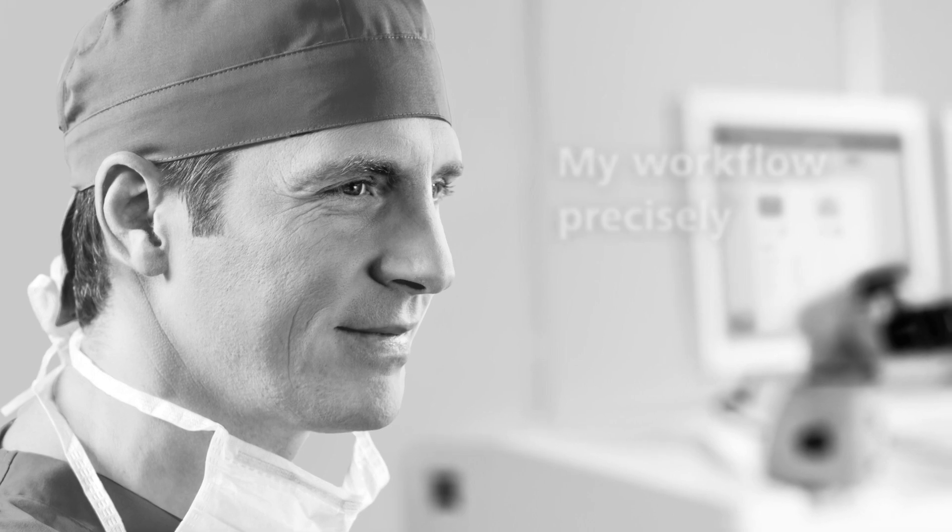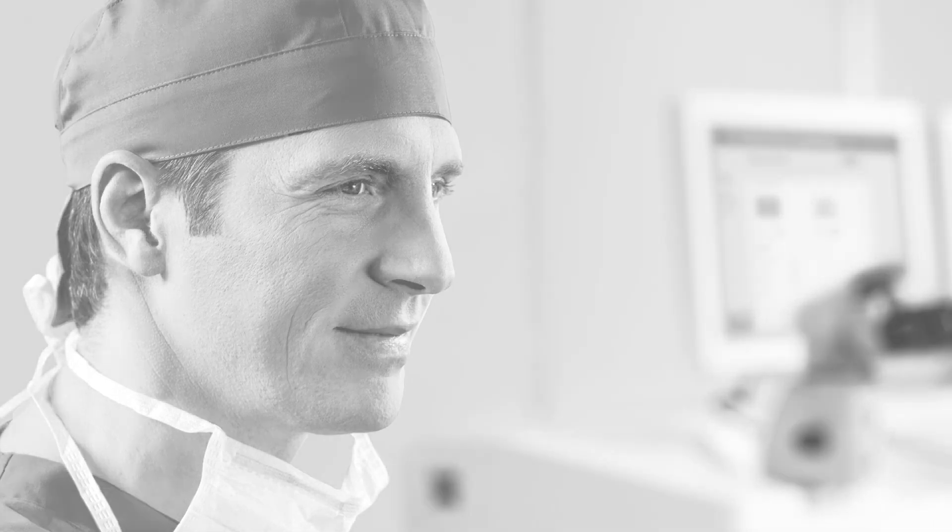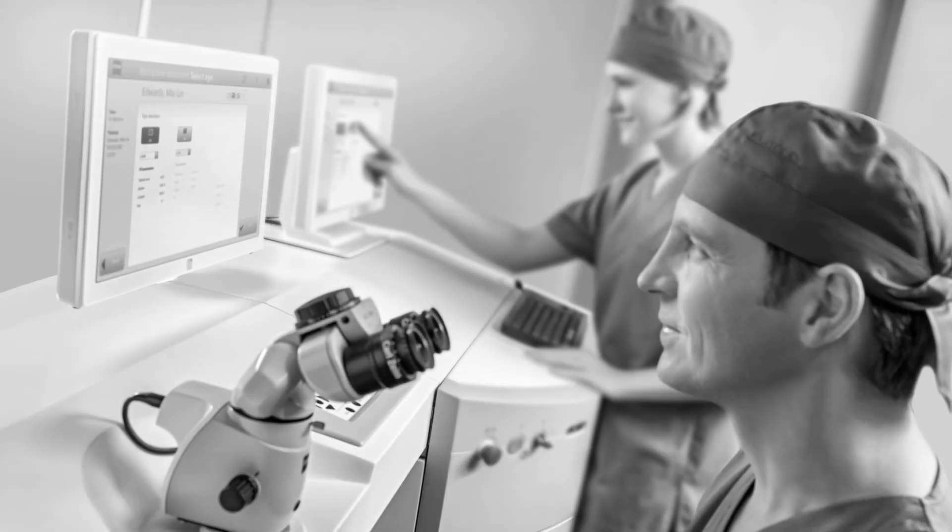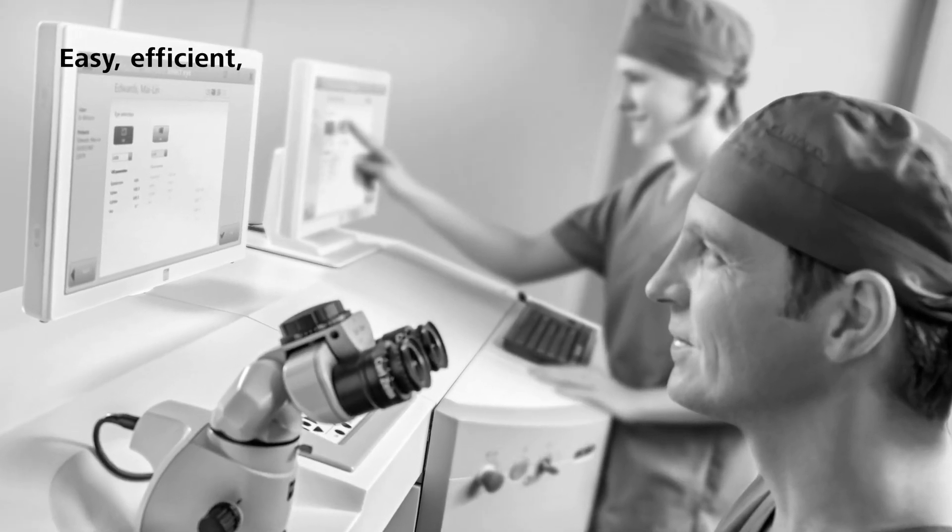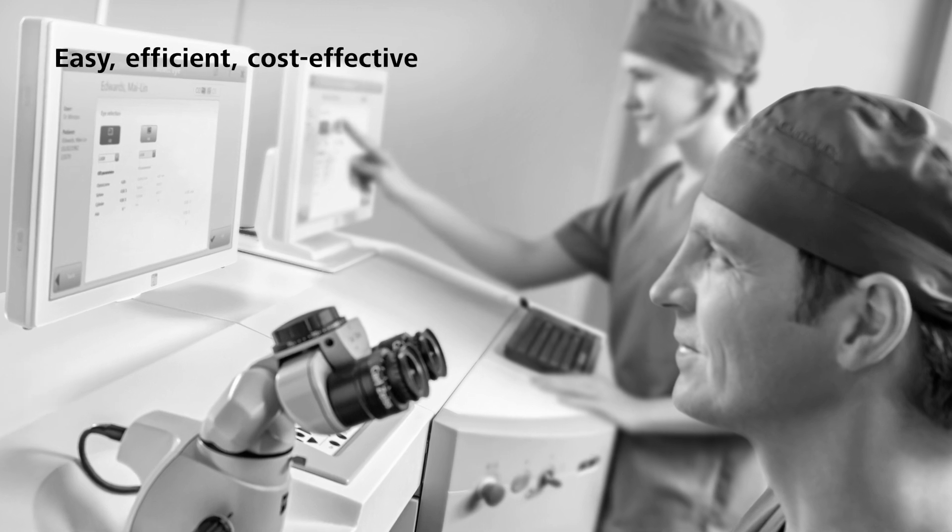A variety of treatment-oriented functions. Easy, efficient, cost-effective.